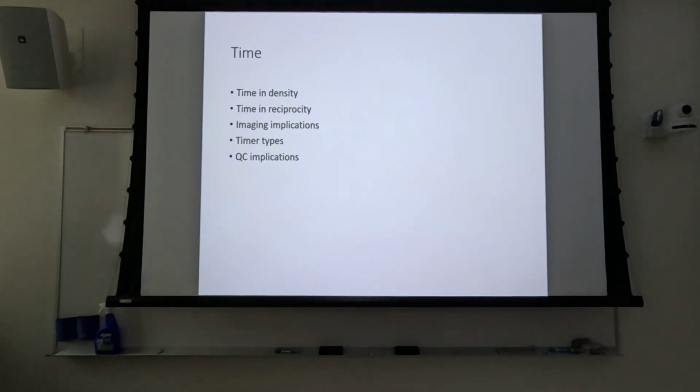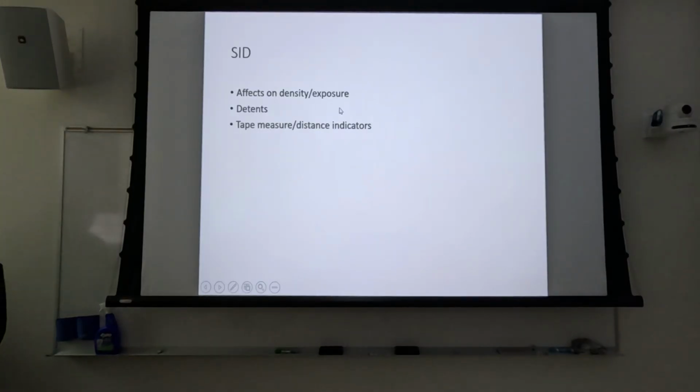Also, remember that at shorter exposure times, you get more erratic exposures as well. So, quality control implications: of course, you've got to do quality control every year.